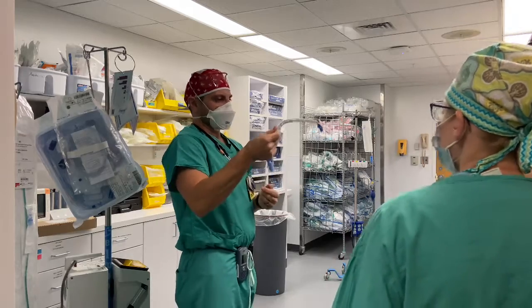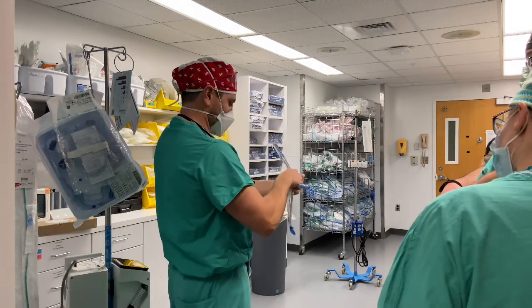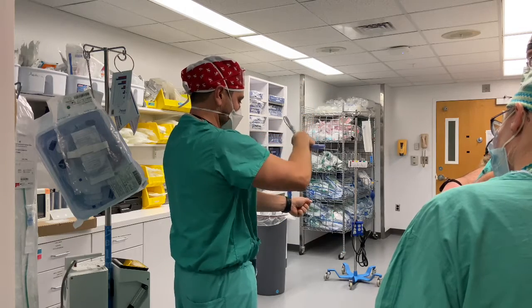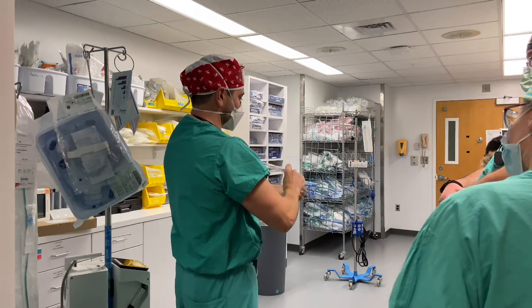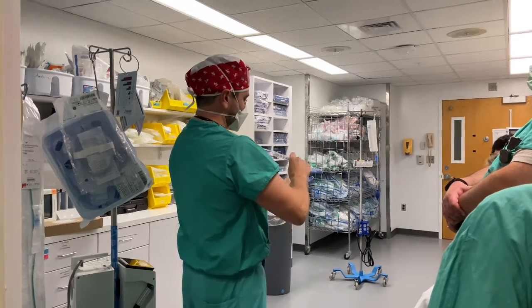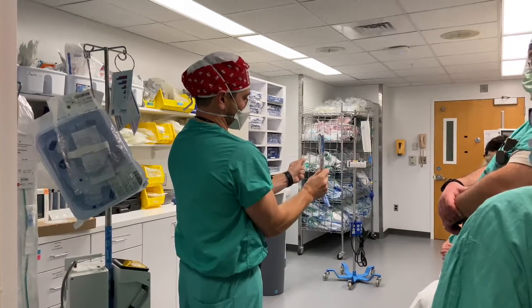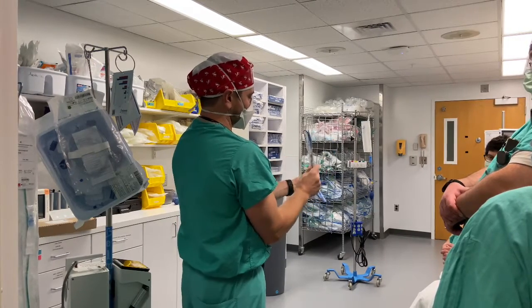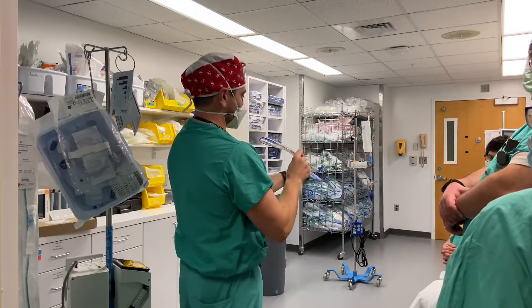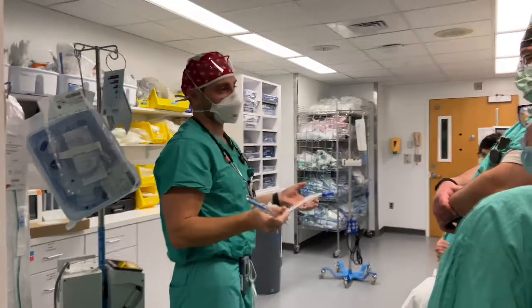So this is sort of a weird curve here, but typically what you'll see us do, your laryngoscopy, we're going to come in this direction, and then we're going to rotate the bronchial lumen, which is the blue lumen, towards whatever side the type of tube is. So if we're going to the right, we're going to rotate it to the right. It's a right-sided tube. If it's a left-sided tube, we're going to come in like this and then rotate it over to the left, just so that the bronchial lumen ends up on the side that we're intending to be on.